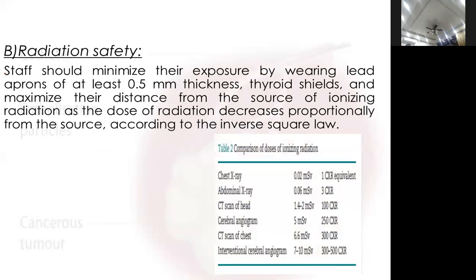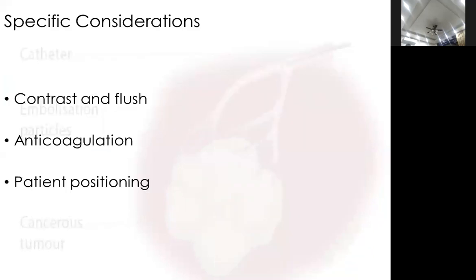We have many radiologists on board, so they are much more expert than me. But if you can compare how much exposure we actually do have in the interventional cerebral angiogram, it's 300 to 500 times more than a simple X-ray. Specific considerations during this procedure are the contrast and flush. As I stress again, contrast-induced nephropathy is a common complication. It might go up to 12% in these procedures.